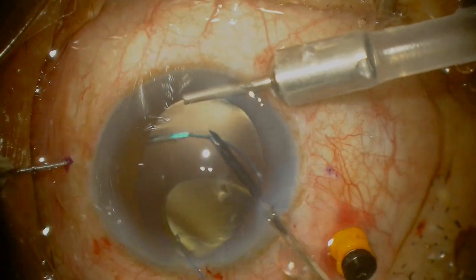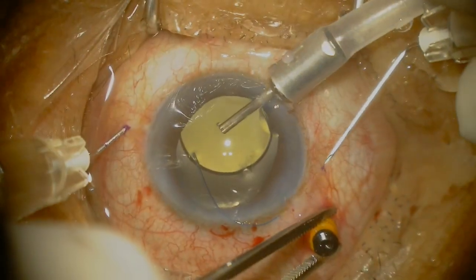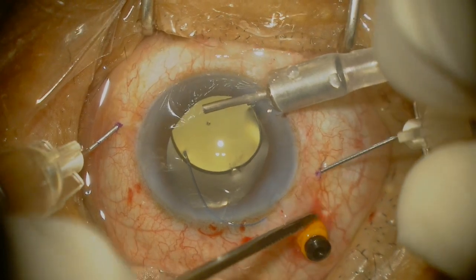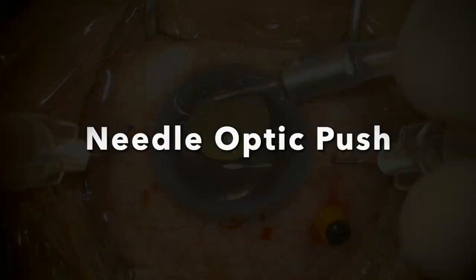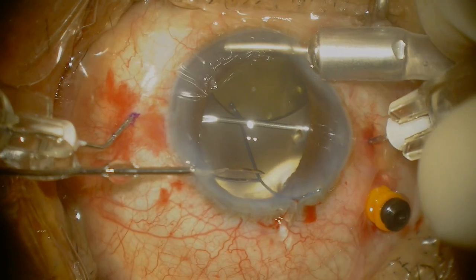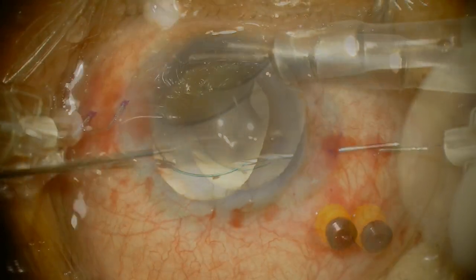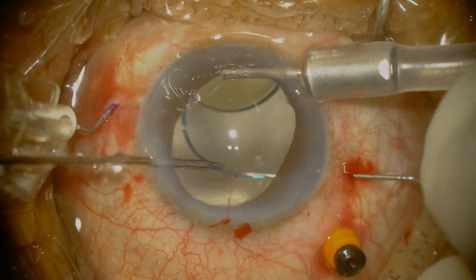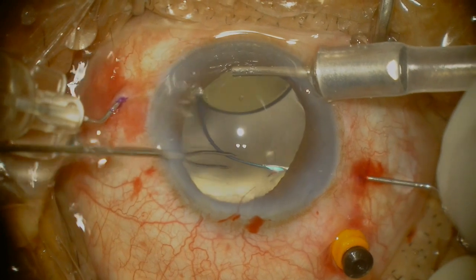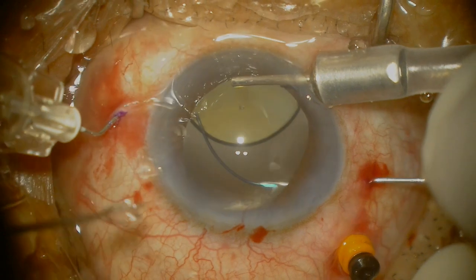Now how much do you bring in? I normally go in about 40 to 50% of the haptic. Coming from the other side — same principle — go in quite flat to the surface of the eye, relatively parallel to the limbus and do the same. The trailing haptic is more tricky to dock on the needle. What I find useful is to use the needle to push on the optic to present the haptic into a good position so that you can grab it, dock it on the needle, and then re-grasp and feed the haptic in gradually.